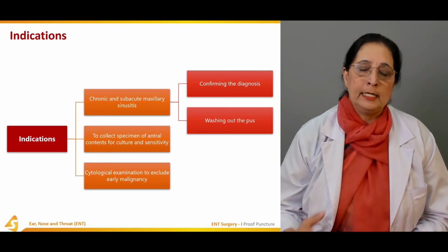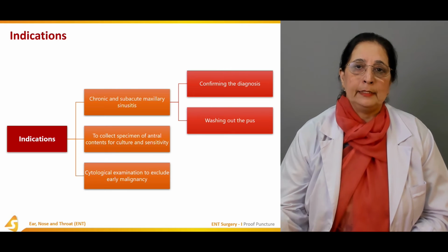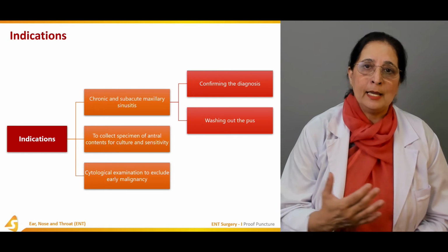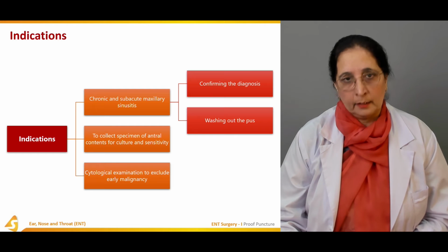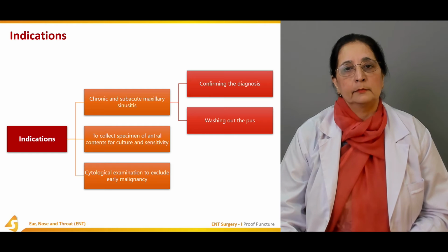So all these are the therapeutic and diagnostic indications of the proof puncture.